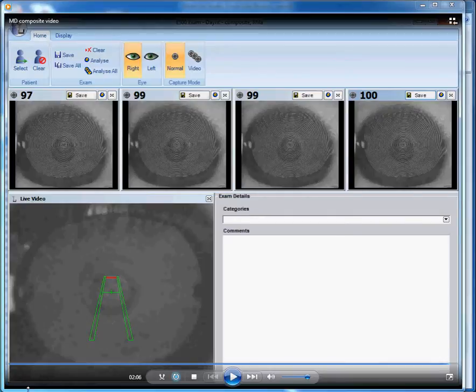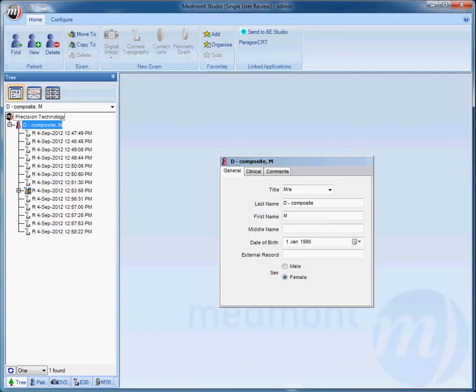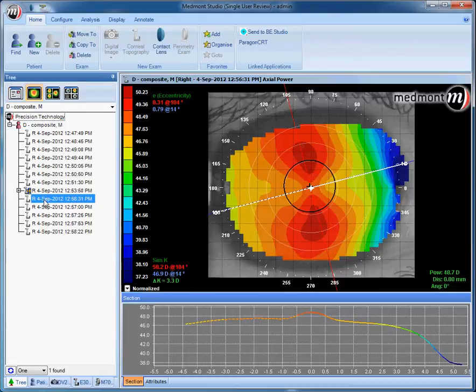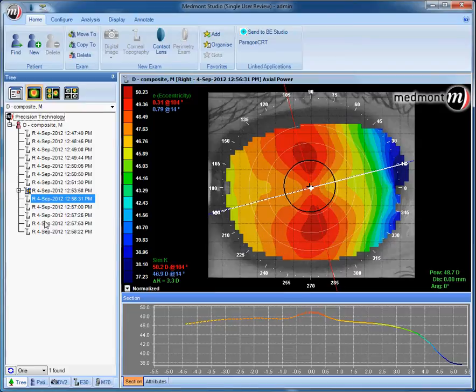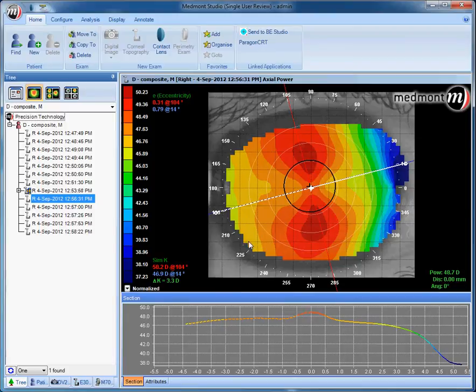Once you have your images, you can individually click on each one of them or click on up to four images at the same time. Effectively, what needs to happen is Medmont needs to convert the placido reflection to a colorized image before a composite eye can be created.